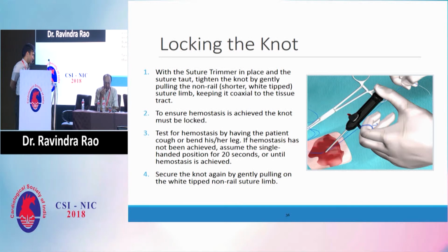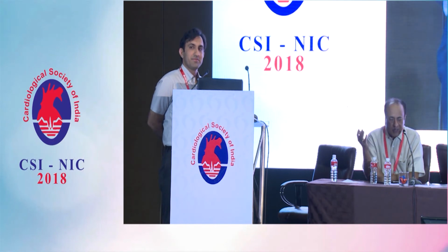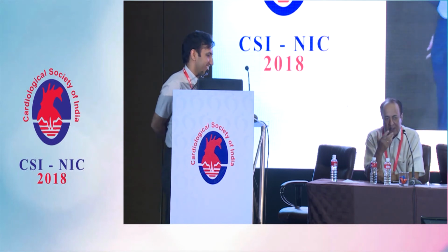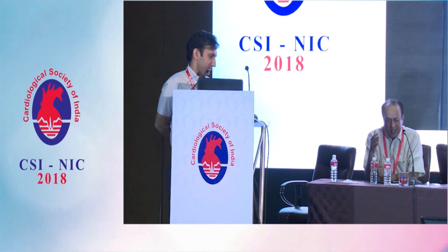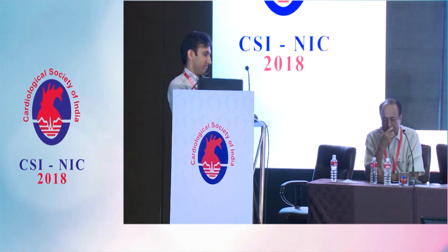So I think we are going to have more and more elderly people, more TAVR, more aneurysm, and more big sheaths. So I think ProGlide is the in thing. I think we should learn everything. I think best is to start up with diagnostic, do consecutively 10, 15 cases, then you will be very confident.